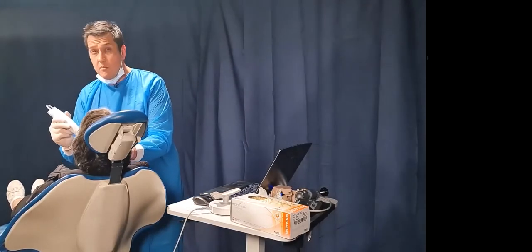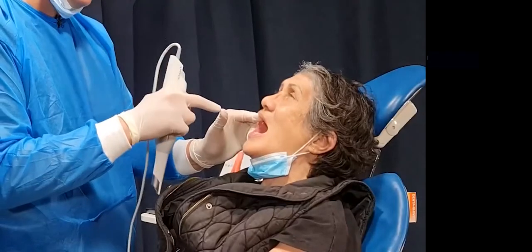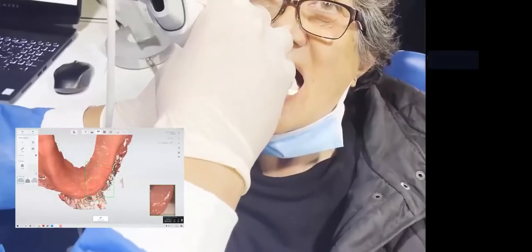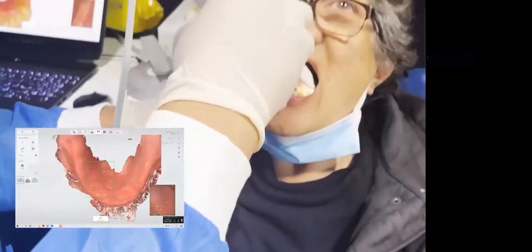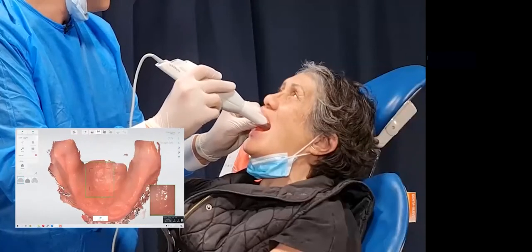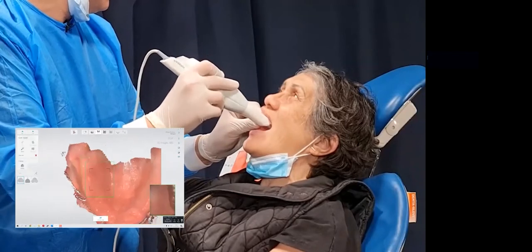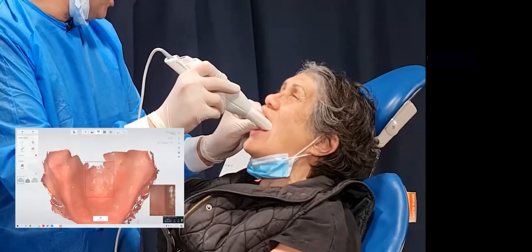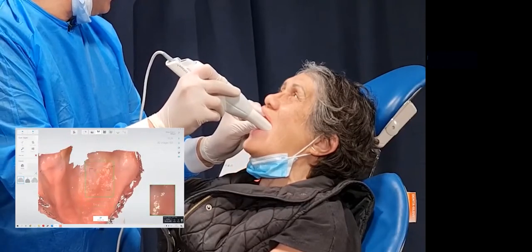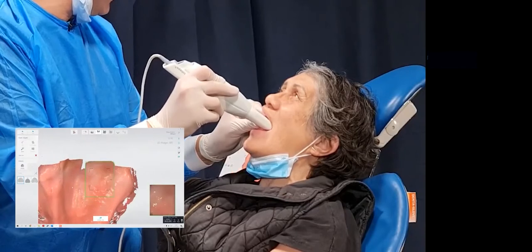Again, I've got my index finger in the patient's sulcus, so that allows a support point for my thumb. So I'm going back in, supporting. Now what I'm doing is starting to fill in the gaps, and I'm linking the left side to the right side. I'm kind of hoping I'll do an overstitch so I can show you it. It's amazing, when you don't want them, you get them, but when you want them, sometimes you can't actually make a mistake. It's a bit weird.